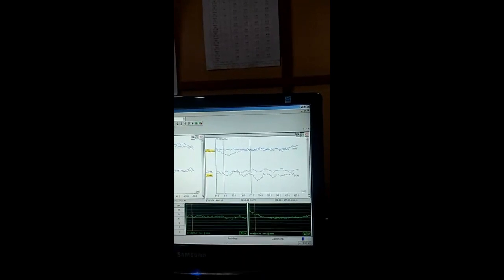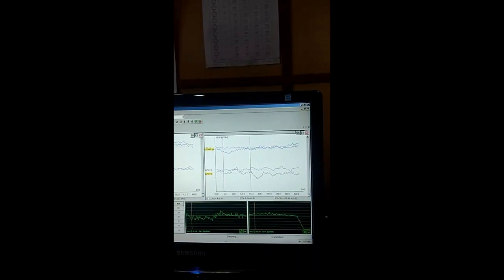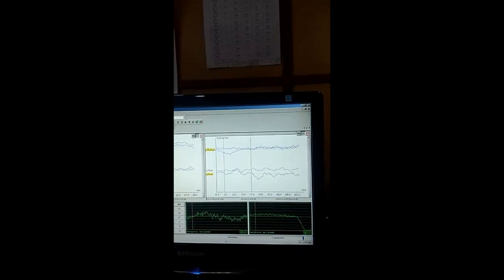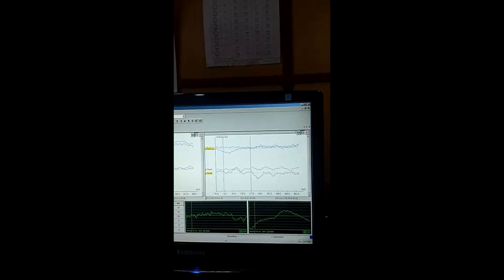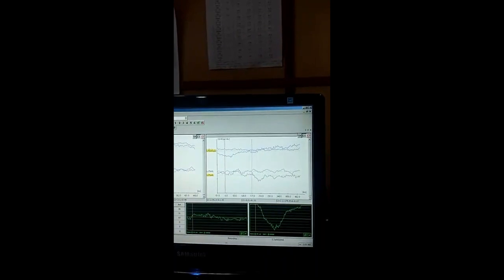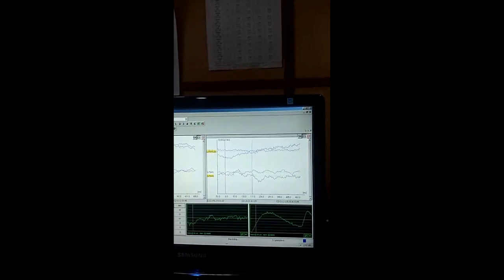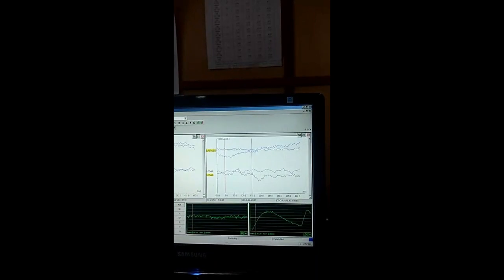What I want you to highlight from this video is that if we look carefully into the EEG, we most often look only into the waveform that we're recording. Instead of just looking into the waveform, look into the EEG background. The EEG will tell you whether there are artifacts or no artifacts. And if you are experienced and you're looking into the kind of EEG you're getting, you can say which artifact is predominantly affecting the recording.